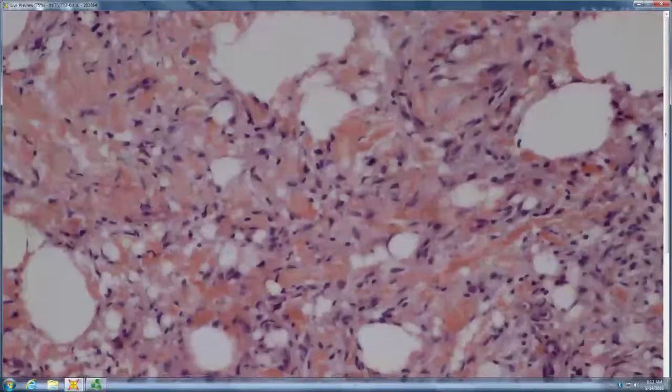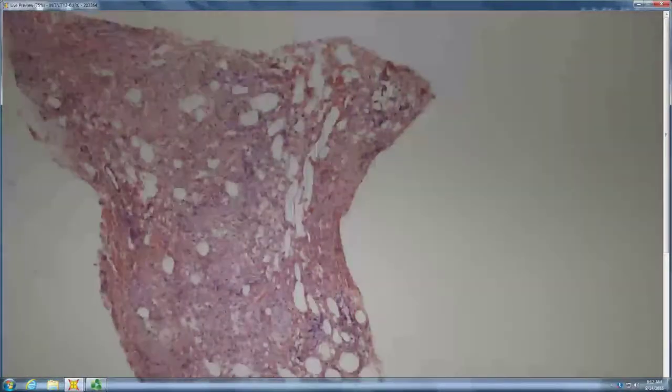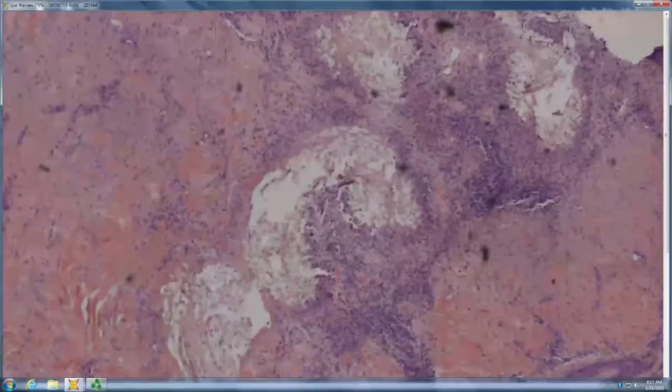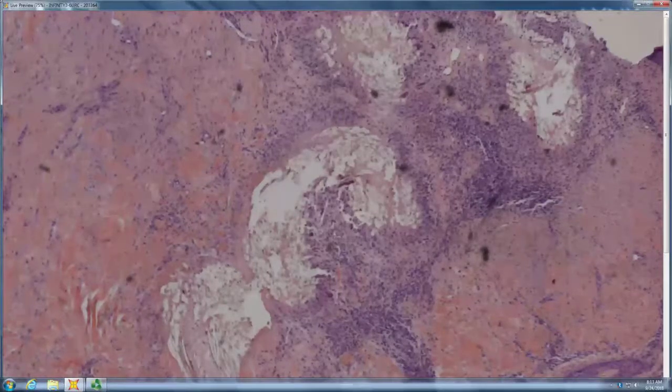So you wonder what was in those little spaces. And in this case, history was prior injection for augmentation at the site. So probably a sclerosing lipogranuloma where some paraffin-like substance was injected. What was the site? Don't know. Could have been a lip or something, although it looked like skin, so it would have been cutaneous, not mucosal.